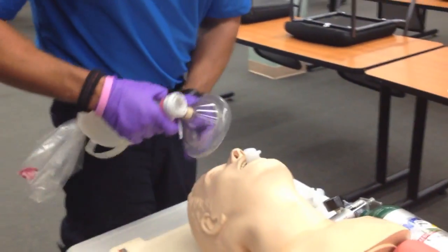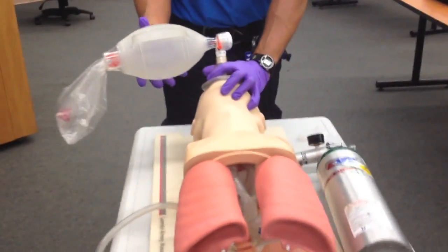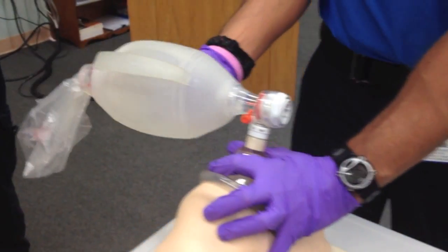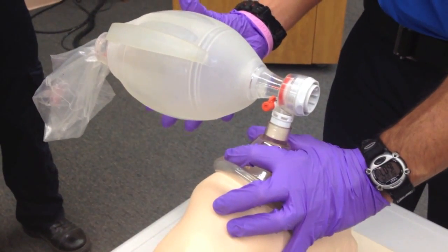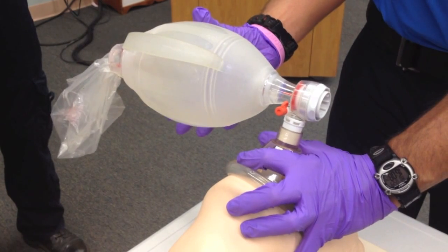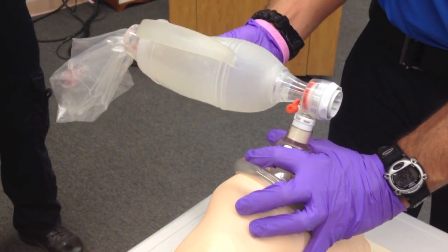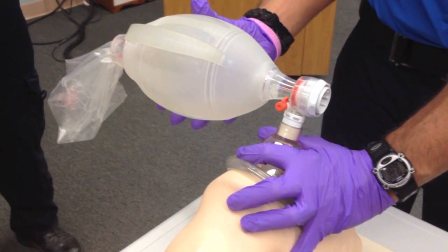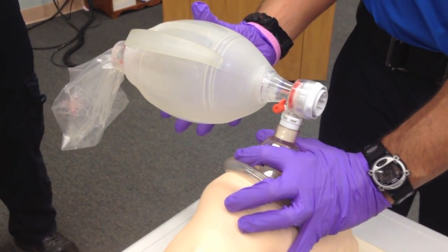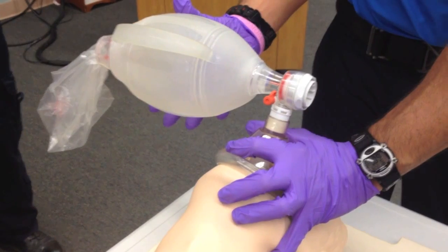I'm getting the BVM ready. I'm going to get a proper seal, reopen the airway, and deliver my first ventilation. I'm delivering ventilations one every five seconds. I'm going to do this for a full minute.